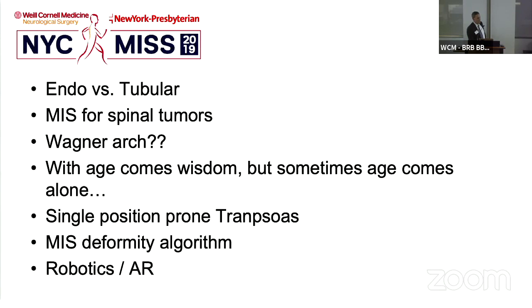And that's where people that we studied this make mistakes, right? Because, for example, they're cannulating a pedicle and they're like, I need to medialize more. And they're looking at a screen and they're medializing, but they're not looking at the patient.